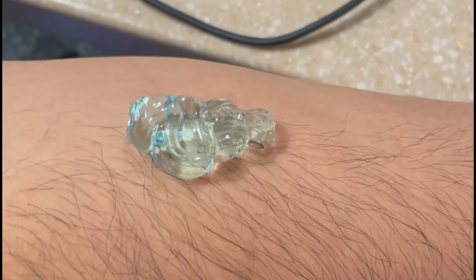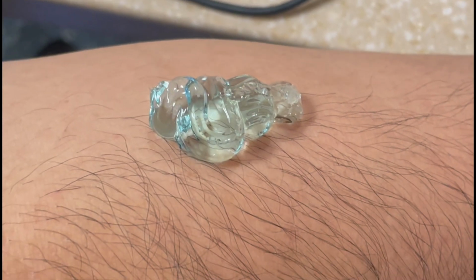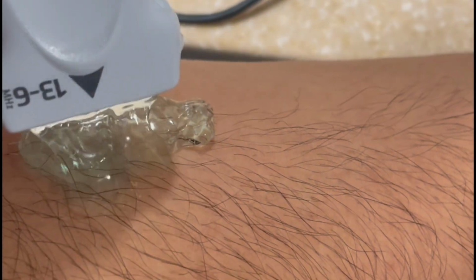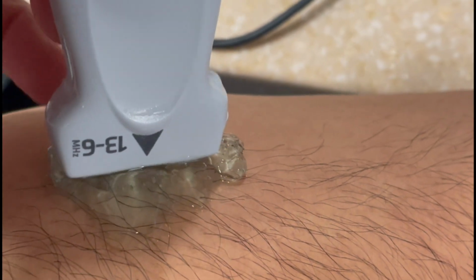Okay, so we've got some basic understanding of ultrasound. Let's get started with the procedure. Okay, so I want to use a good amount of jelly. Sometimes when you're doing this over an abscess, the skin can be sensitive, so if you use a lot of gel, you won't have to push very hard.